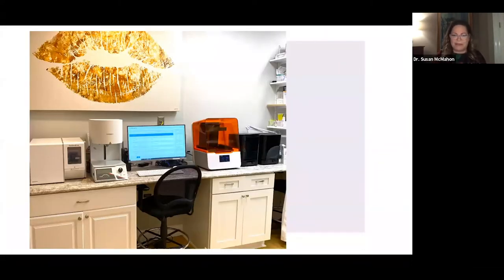So here it is in my office. This is our setup. We've got our mill, we've got an oven, we've got the design computer, we've got our printer, and then the wash station and the cure station. And this is in a hallway where patients walk. We always encourage them to go back and look at this stuff. Anytime it's running, I want them to come back and see it. I want them to shoot video of it if they're interested, and I certainly want them to talk about it. So not hidden away. It's really clean and sleek looking, and it doesn't take up much space at all.